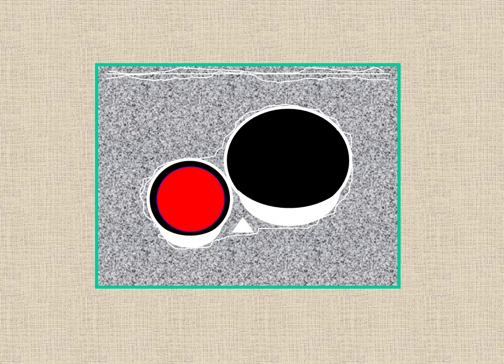This means that the same blood vessel, such as the carotid artery, will be blue when the probe is pointing towards the ear, with the blood now flowing away.